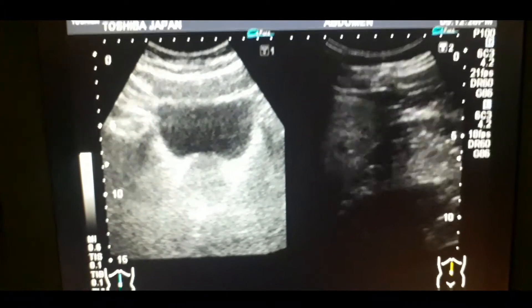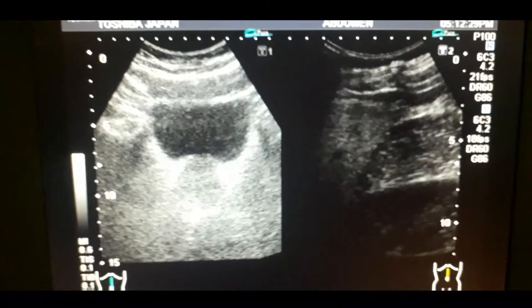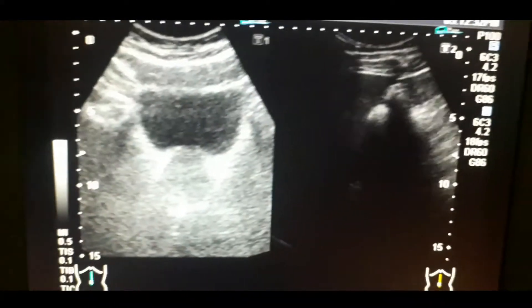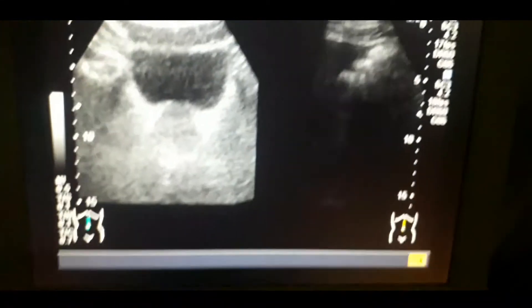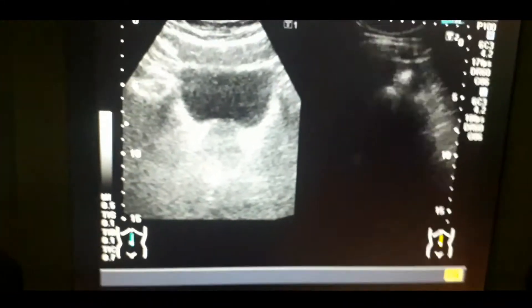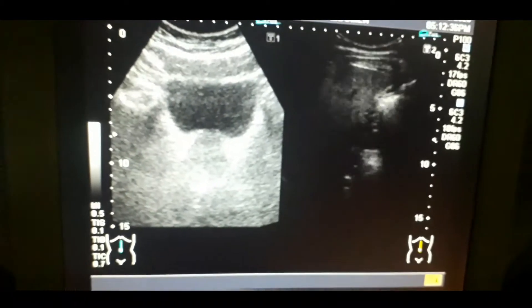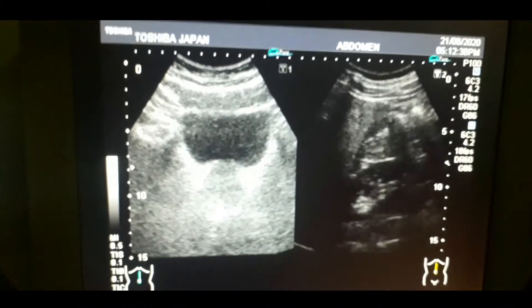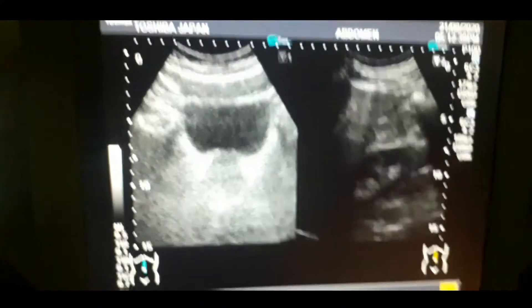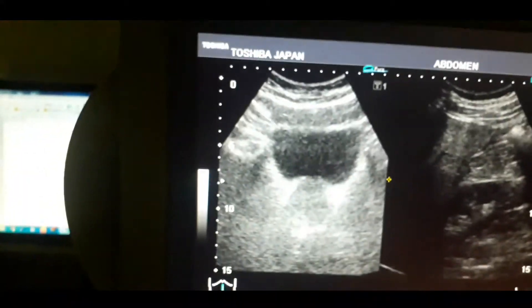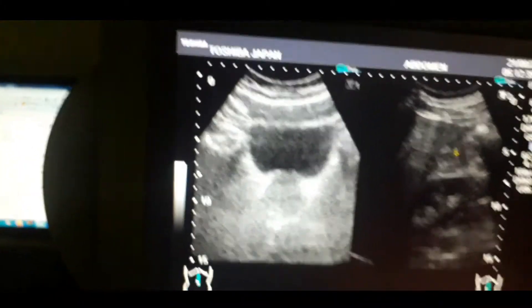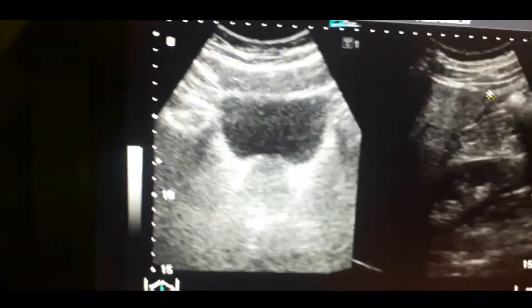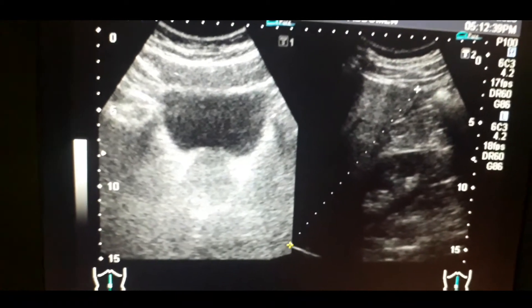Right seminal vesicle cyst. You can also see the kidneys to find out the pressure symptoms related to the seminal vesicle cyst and BPH. The kidneys are normal — there is no hydronephrosis.